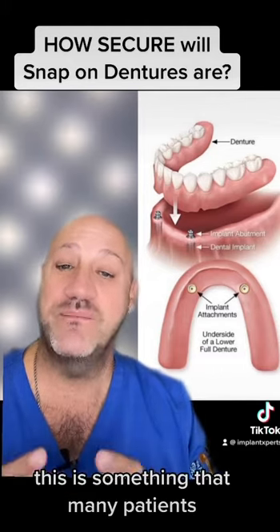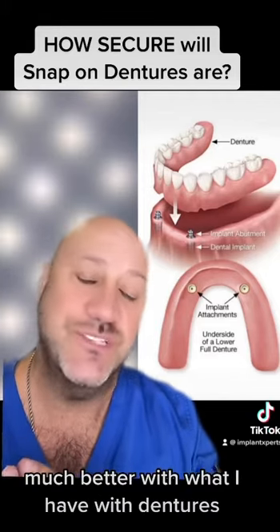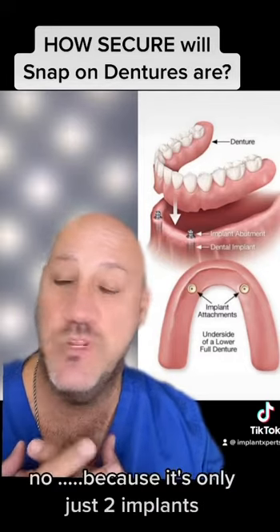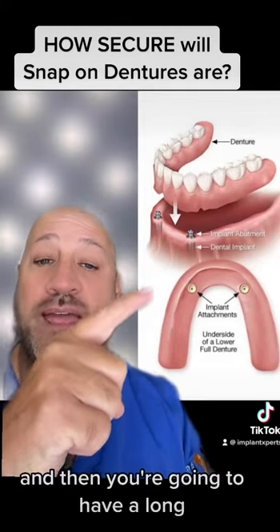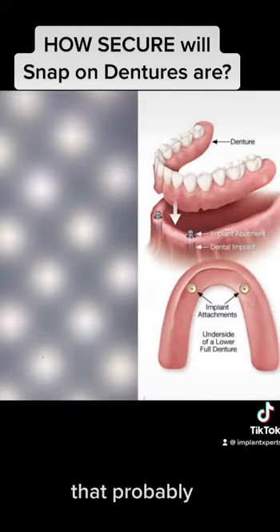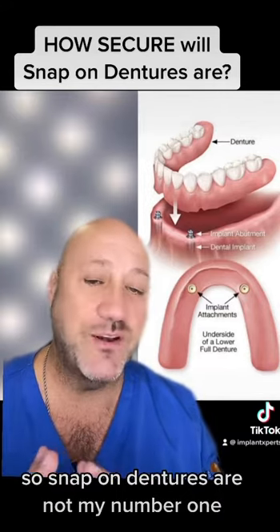Many patients ask, am I going to be much better with snap-on dentures than with regular dentures? Yes, you will. But are snap-on dentures my favorite? No, because it's only two implants. As you can see here, you will have two implants in that area and then a long way back that can make it wiggle — so it's not the best option.